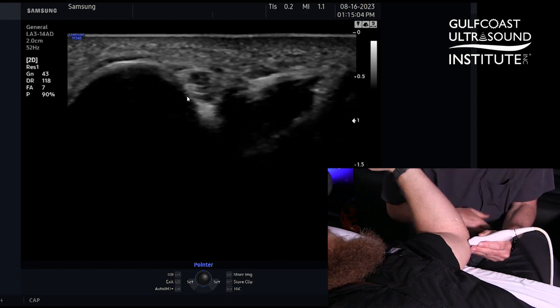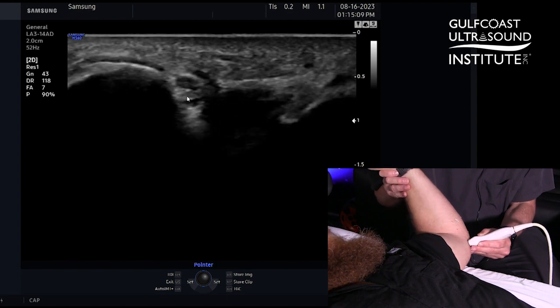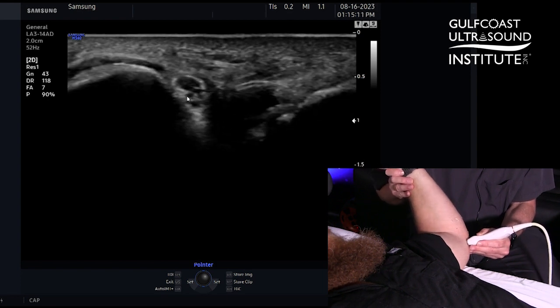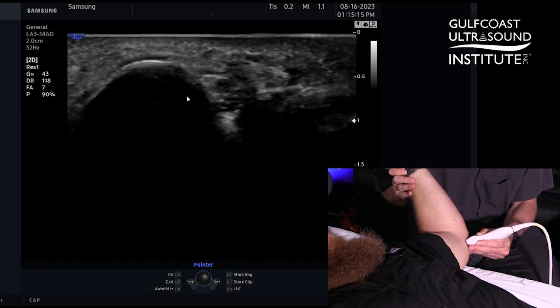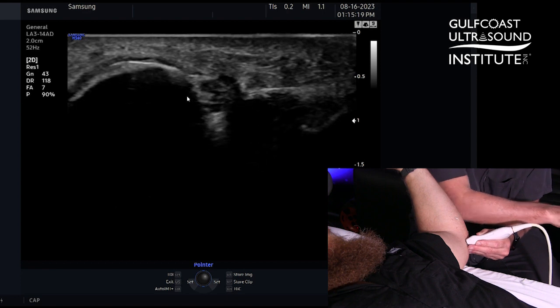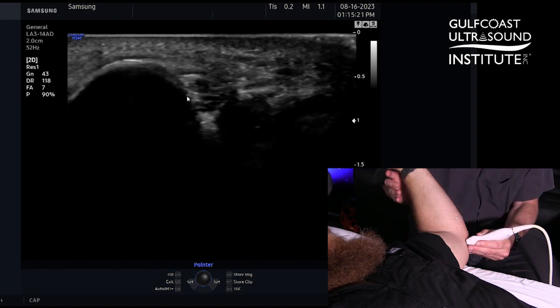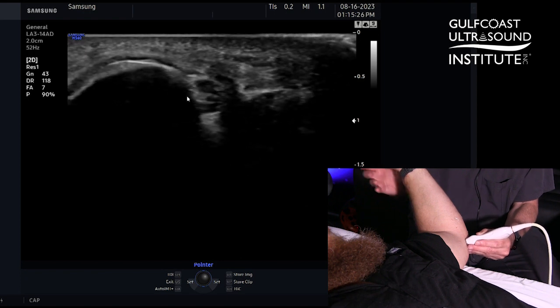Now, when we move the elbow, those two bony landmarks will come closer together and move apart. So when we do a dynamic assessment, we use fixation on one — and we usually pick the medial epicondyle. I'm going to put my ultrasound transducer on the medial epicondyle. We'll fix that, and now we're going to see the ulnar nerve there by the arrow.